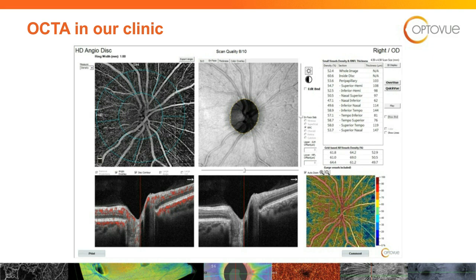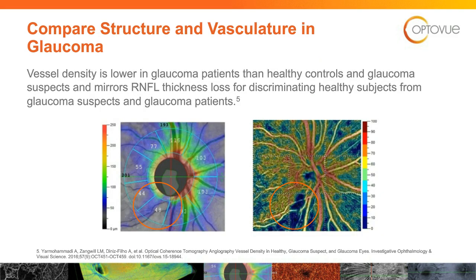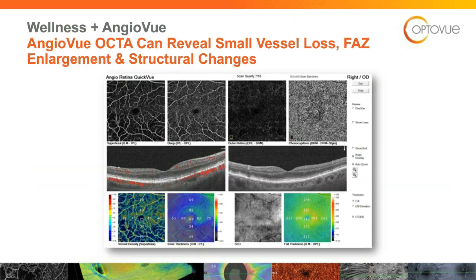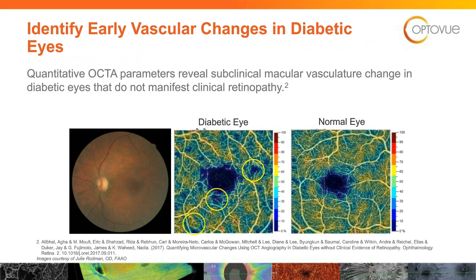And we've seen how all those images look, but that's how I get to the images and the numbers that I want to look at in my diabetics as I'm interpreting this. Again, go back to ONFOS, that tab, and then over the left and look at F.A.Z. And when you hit F.A.Z, it's going to look just like this.